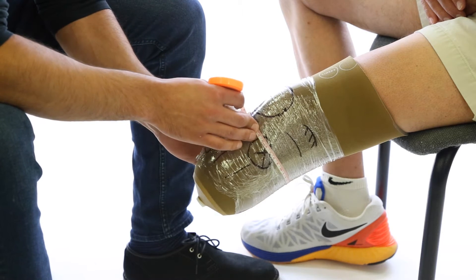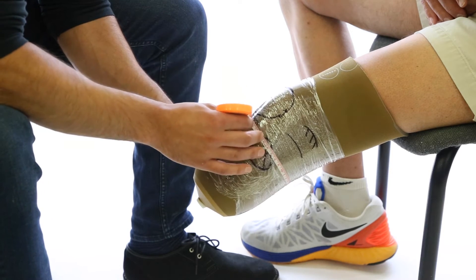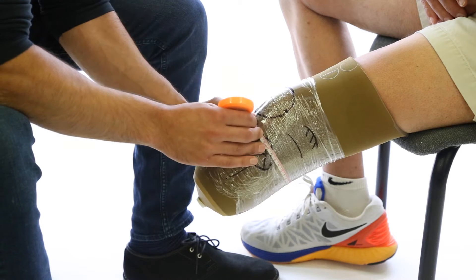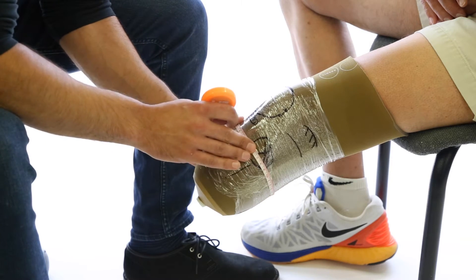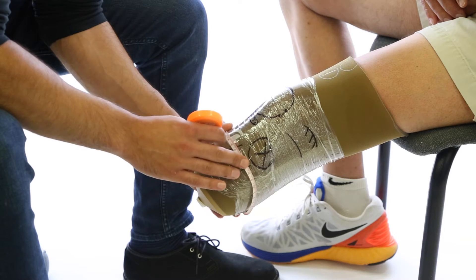Next are the circumference measurements. In the case of a pin lock, we need to take circumferences from the mid-patellar tendon down every 2.5 cm. In the case of a suction socket, we need to take the same measurements and specify where the proximal seal and the distal seal are for the suction liner.